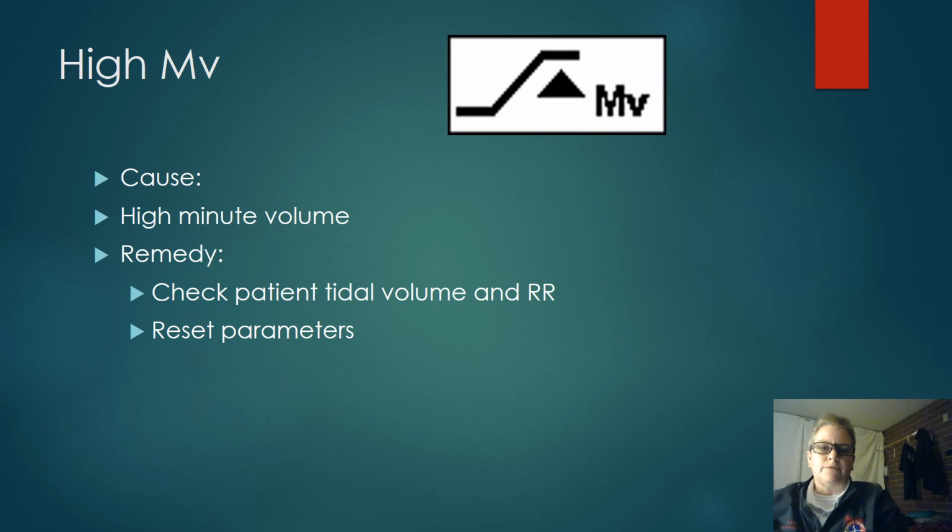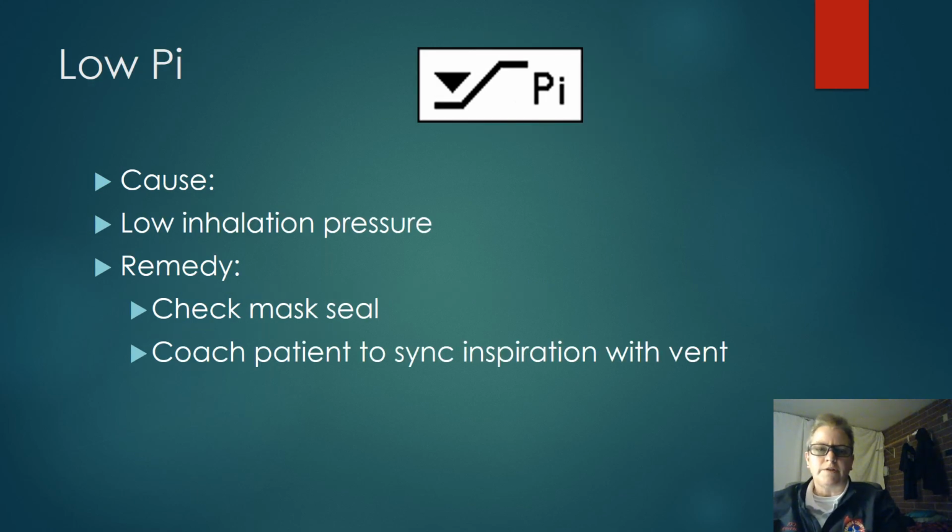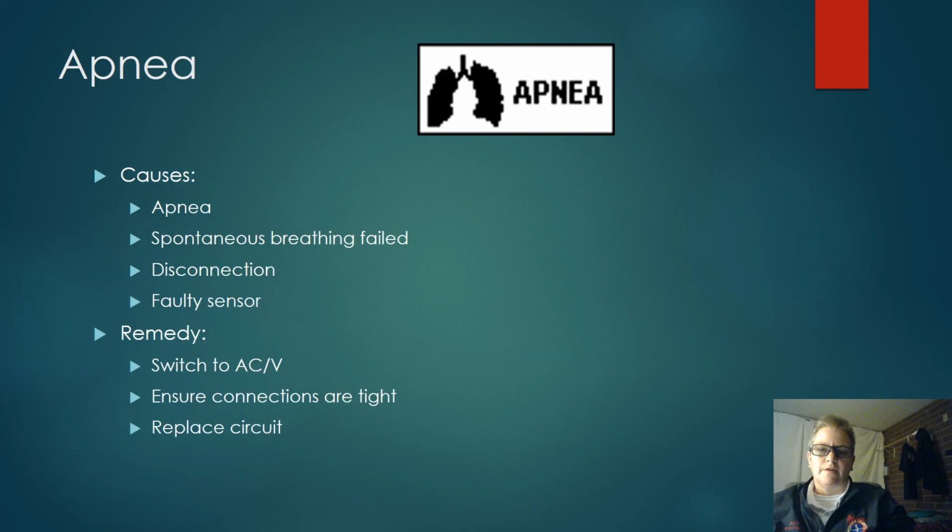Okay, high minute volumes. So guess what can cause it? High tidal volumes, high respiratory rates. Reset. Low inspiratory or inhalation pressure. Check your mask seals. I found that coaching the patient to not fight against that exhalation, stop talking, all those might help with those low and high inhalation pressures as well.